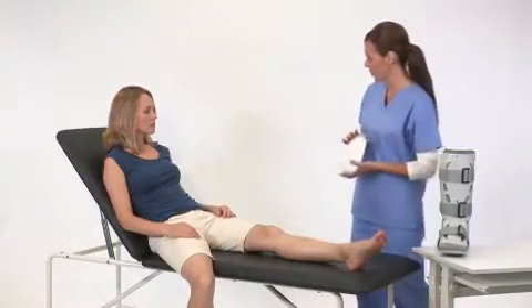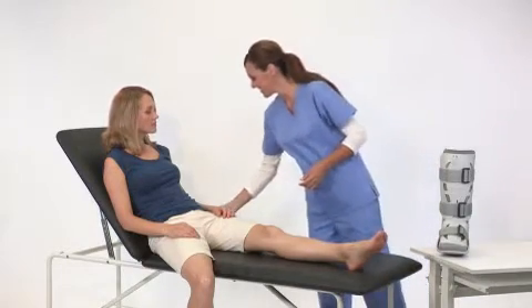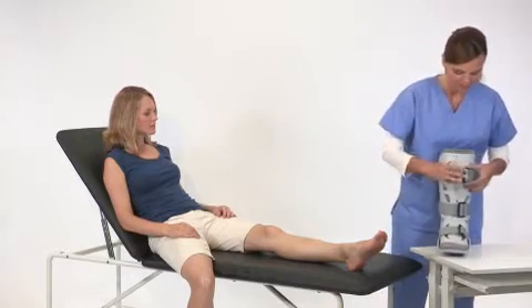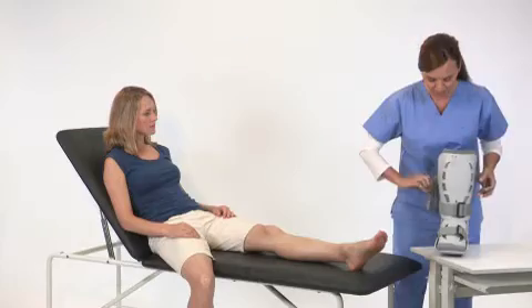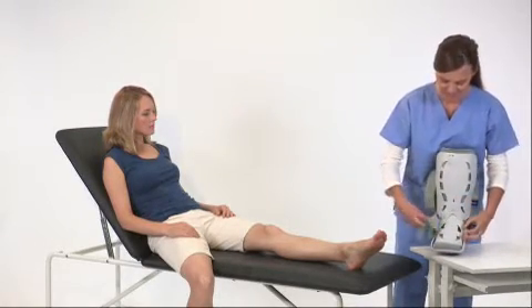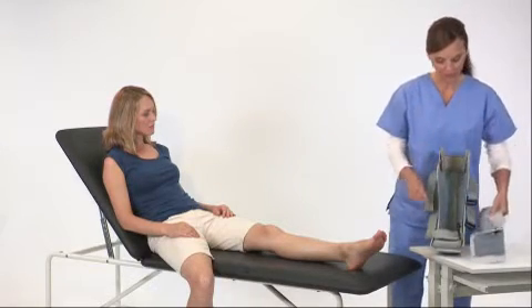Your XP walking brace includes an inflation tube and two cotton socks for enhanced comfort. Start by preparing the brace. First, unfasten the straps. Then remove the front panel and open the toe cover and foot flaps.